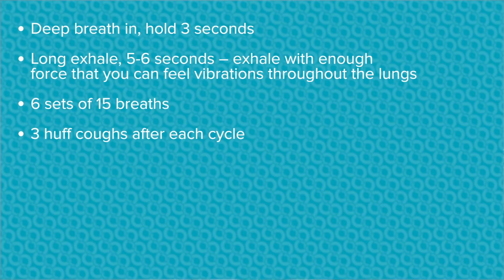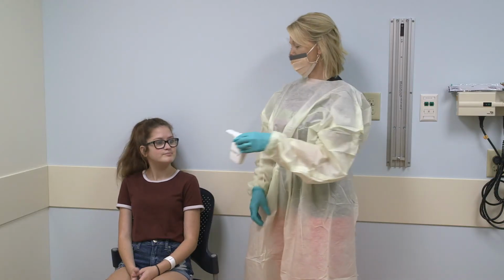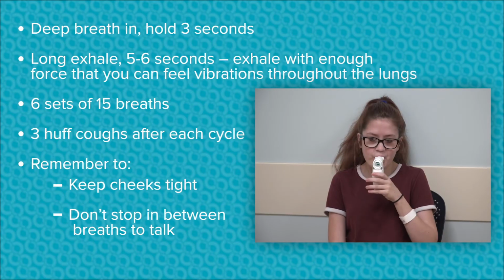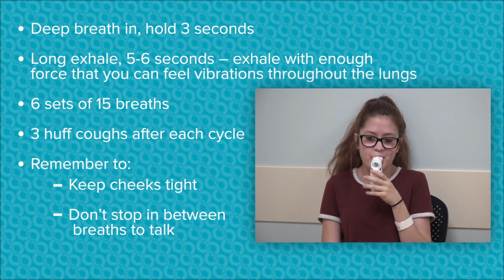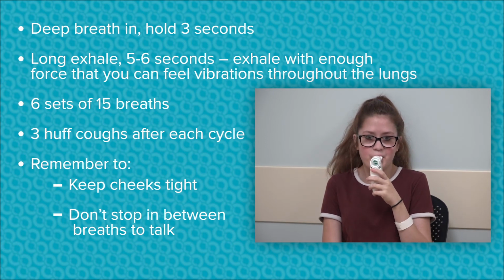If we're instructing Sam on how to do this, she wants to take a big deep breath in and hold it for about 3 seconds, and then make sure she exhales long enough for about 5 to 6 seconds with each breath. And she's going to do 6 sets of 15 breaths like that. So she's going to demonstrate one of those cycles for us. And a good breath hold and blow. Good breath hold. 1, 2, 3, 4, 5. Big deep breath in.